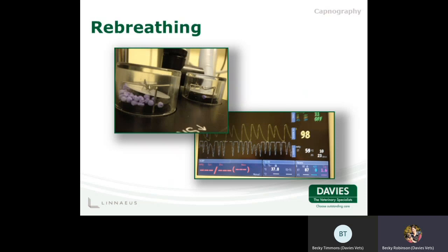And the reason for this was that we had a malfunctioning inspiratory valve on our circle breathing system. And that was because somehow some of the soda lime or carbon dioxide absorber had got caught between the valve, so it could no longer close. So we no longer had the unidirectional flow of gas through the system, and it ended up with the patient rebreathing significantly.